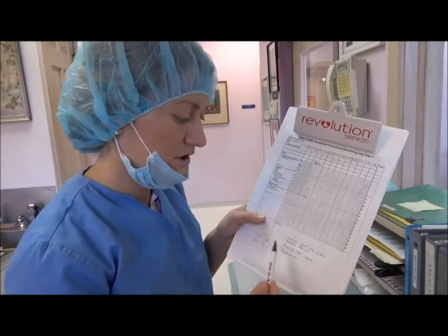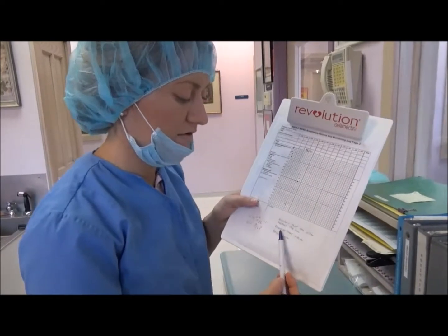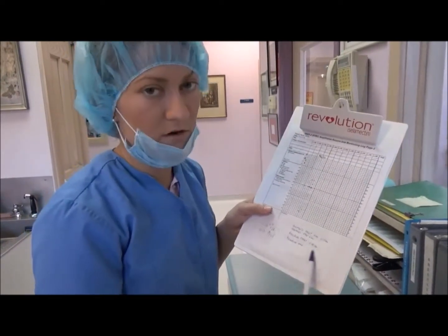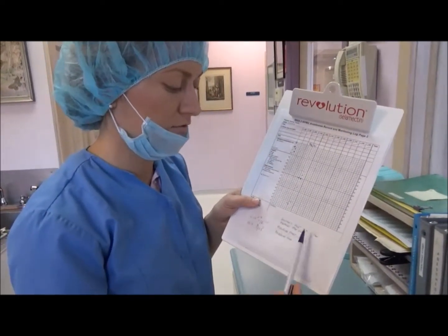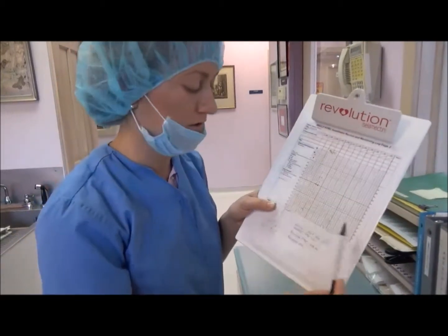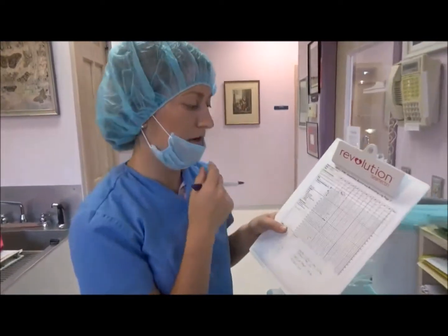Other things that you want to chart, of course, your anesthesia start time, anesthesia stop time, and then your procedure start and stop time. On here I make my rough notes, and then in the computer system we actually have a more detailed form. We'll input these numbers, and then I'll also scan in this form once it's completed. So it's been about 5 minutes and we're ready to check on our patient.